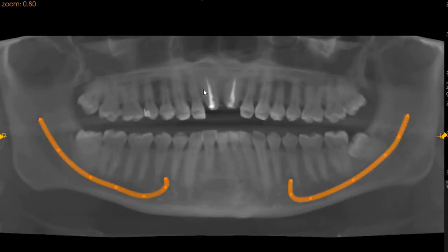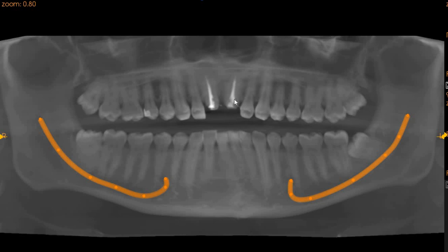Moving to the panoramic view, here we can see that the two teeth have been root canal treated and do not appear to have any prosthetic restoration. The crown cutting has been done.